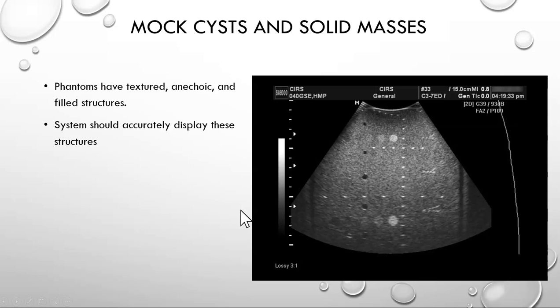Mock cysts and solid masses. Phantoms generally are filled with things that appear as solid masses and with cysts, and you should be able to see them with your system.